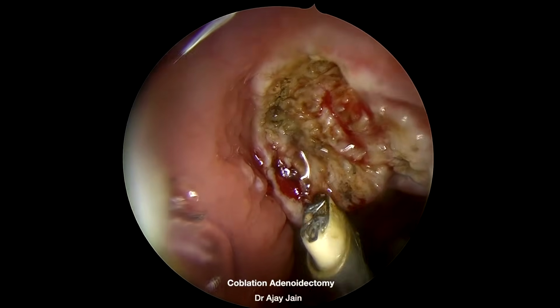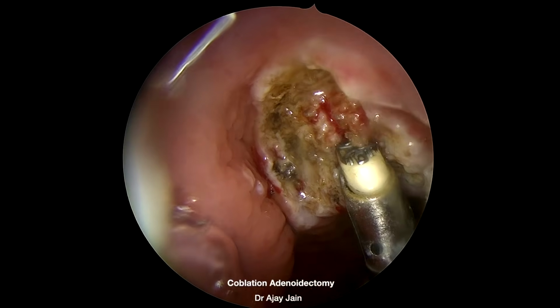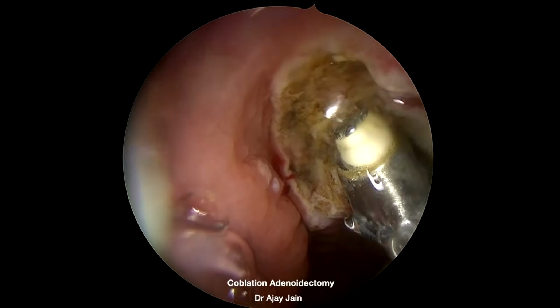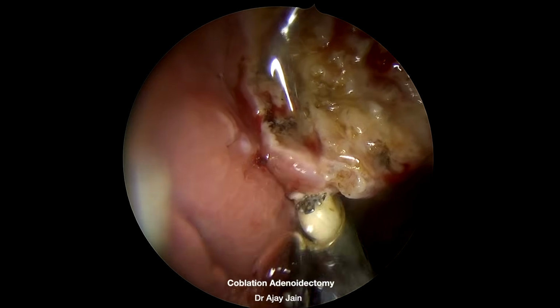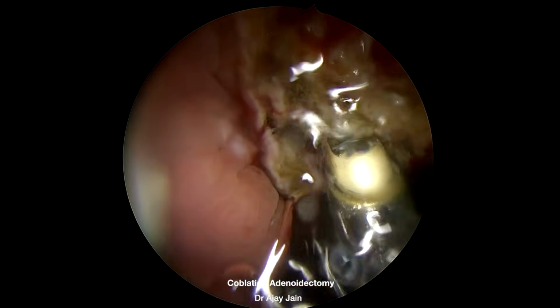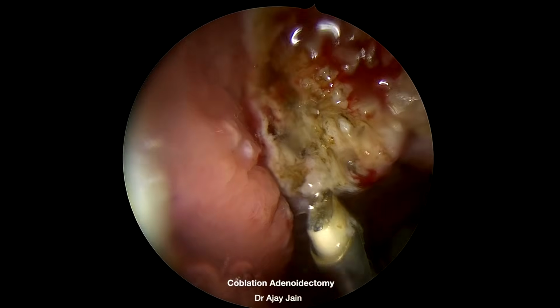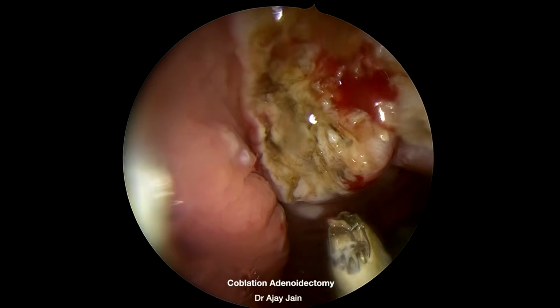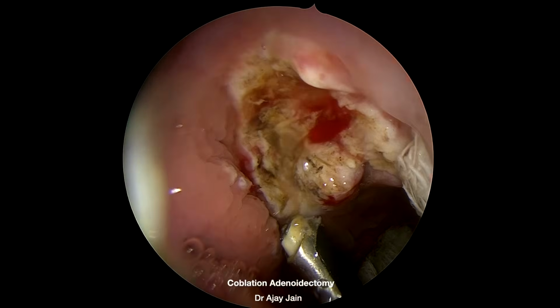The dissection is extended towards the fossa of Rosenmuller, clearing residual lymphoid tissue while preserving the normal anatomy. You can see even the smaller bleeding points are being cauterized so that the field remains clear, and I've identified the posterior lip of the eustachian tube, and I'm going towards the fossa of Rosenmuller. I'm doing layer by layer so that I know how much I have dissected.